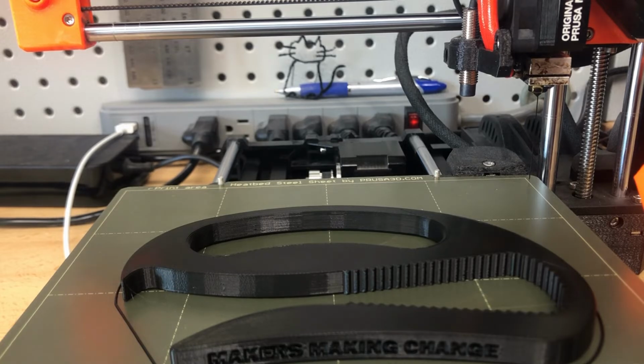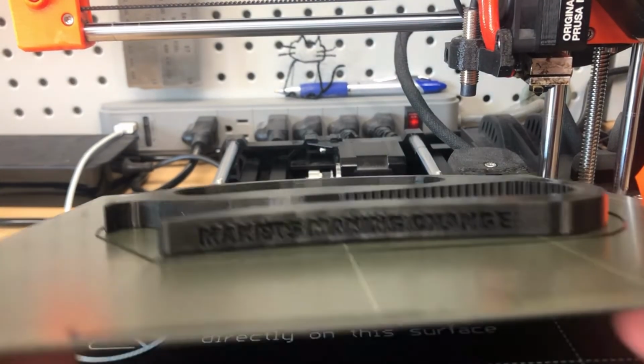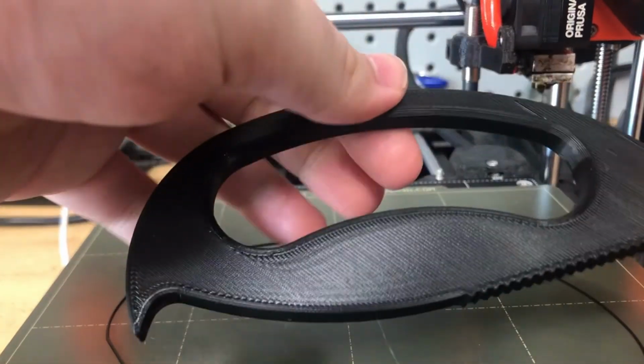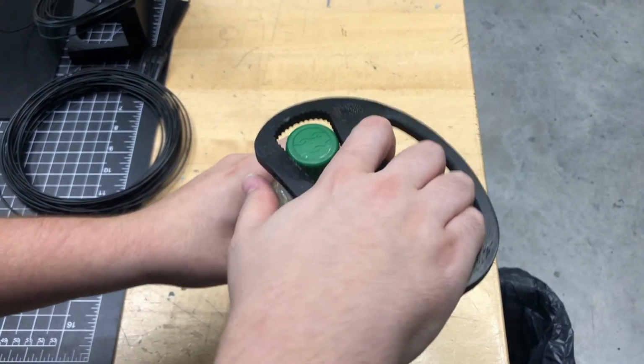Now, there are a variety of existing files out there that you can try out and use. If you have the time, it's awesome to find a few that you might commonly use in your practice and have backups that are ready to go. That way you don't have a patient that's waiting on a 2-hour, 3-hour print to come out.